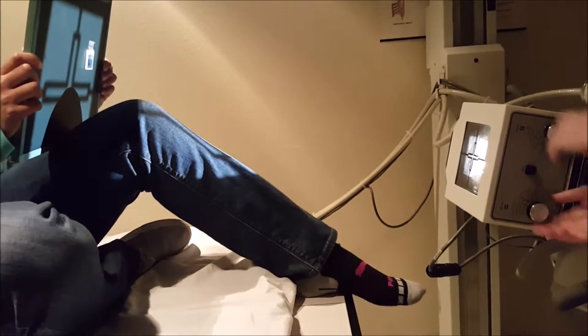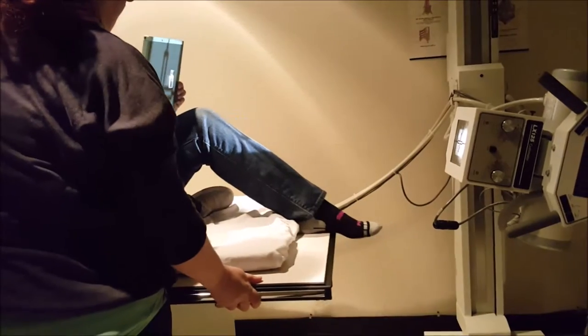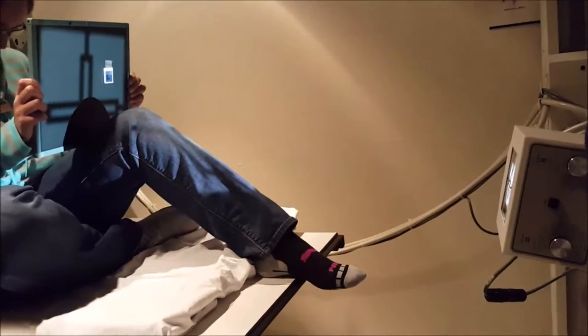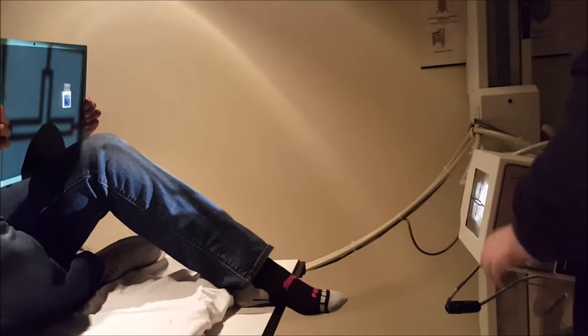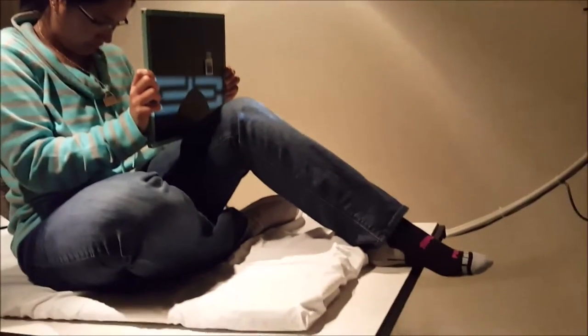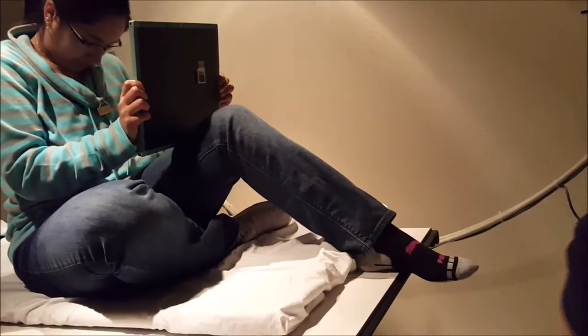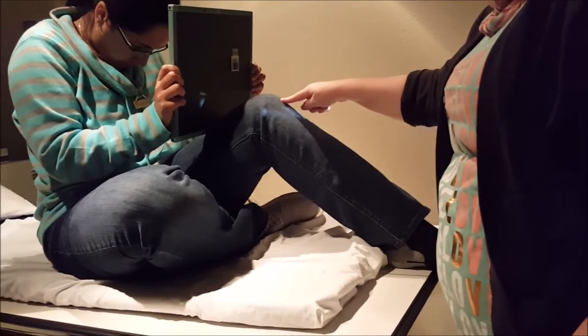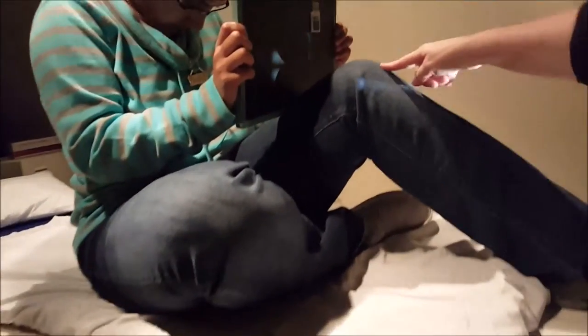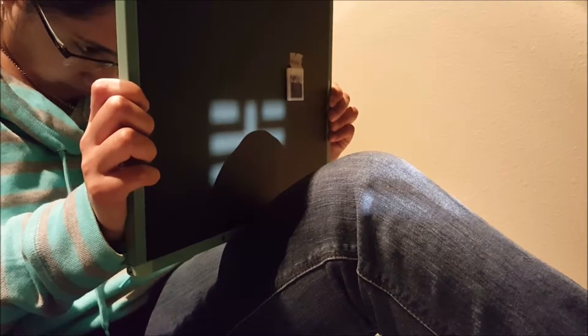You want to keep your 40 inch SID. I can move my tube back more, but let me move the table here. Sorry, it's going to black you again. That's about 40 inches without a measuring tape here. I can't really tell, but that's about right. And what you're going to do is you're going to center right to the patella from that space. Here's her patella, here's the apex, and I'm just right at the apex. So I know I'm going right through that space. So your collimation should look pretty similar to that.